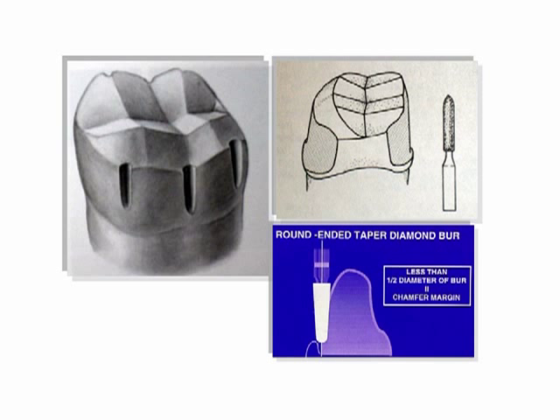The head of the handpiece should remain perpendicular to the occlusal table of the tooth. The wall of the preparation supports the burr. This allows a smoother surface finish. Persistent stopping and starting of the handpiece results in an inconsistent surface. The tapered diamond burr, if correctly used, should not produce undercuts. The burr should be maintained in contact with the axial wall for the entire circumference of the preparation.